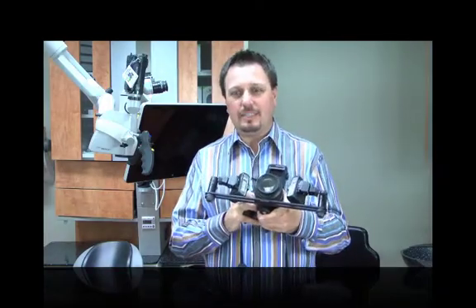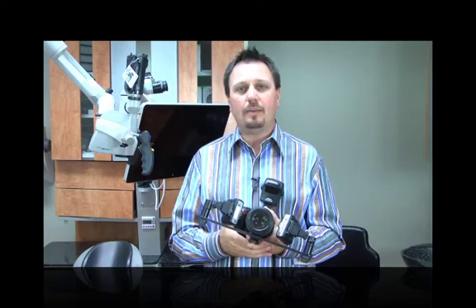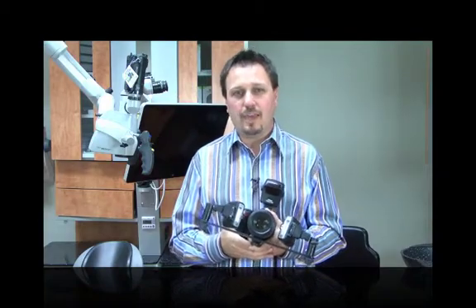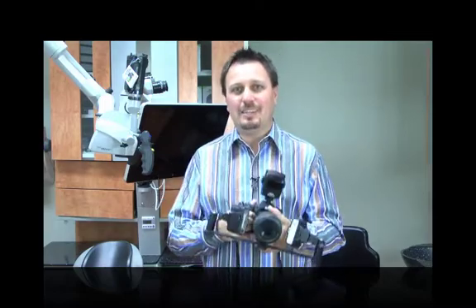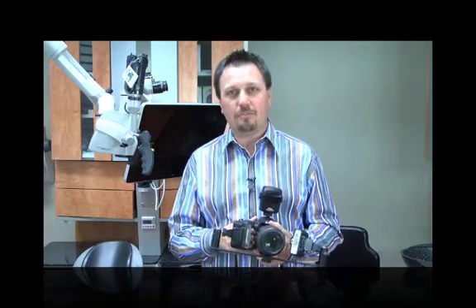I want to talk about the D7000. My wife was due to get a new camera and after looking at all the features of the D7000, I thought it would be a fantastic camera to buy her for her birthday. One great feature is that it's not huge — compared to the D3s and D3, it's a lot smaller, more compact, and lighter to carry around, especially on vacation and even in the dental office.